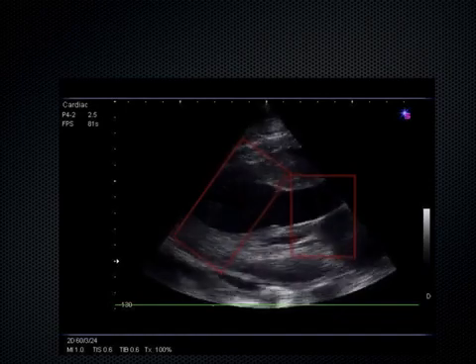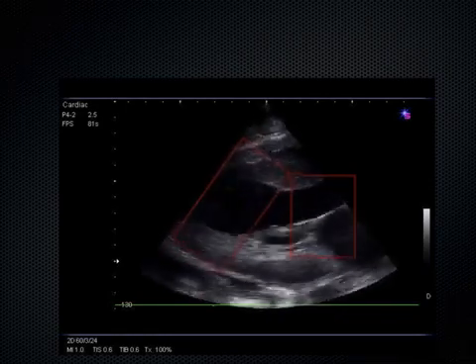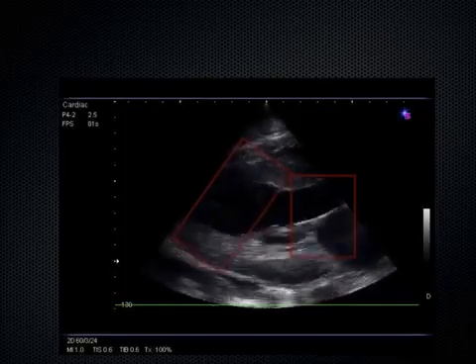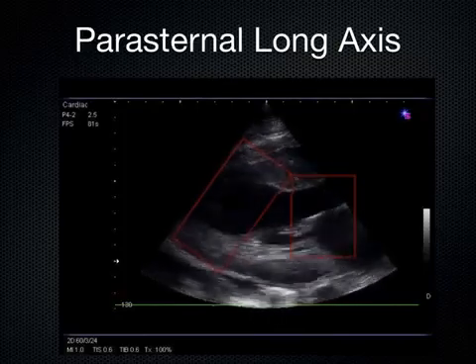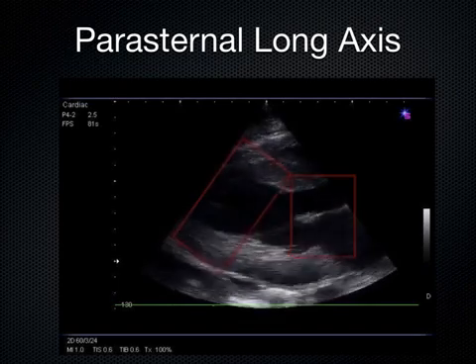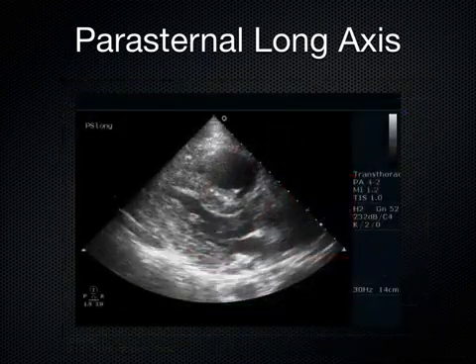Because when the nurse comes to you and says, hey, this patient's hypotensive, we've got to resuscitate this guy, how much fluid should I give him? That's their first question to you. So you just got to be very careful that you don't just start dumping fluids into a heart that looks like this. That's why, when anybody's hypotensive, I immediately go to the bedside and take a look at their heart, and then I make a decision about whether or not to give fluids at that point.